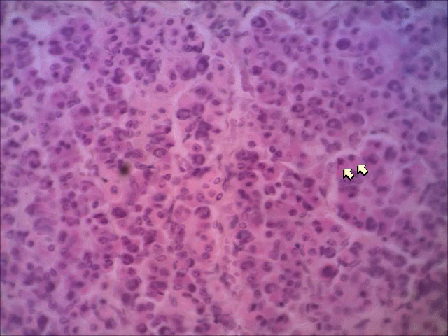These cells produce some of the hormones of the anterior lobe, and then the basophil cells, which have the bluer staining granules, because they're basic, therefore called basophil, produce other hormones of the anterior lobe. Again, you don't have to know which hormones are produced by which cells or even the names of these cells or the hormones. I really just want you to be able to distinguish between the anterior lobe and the posterior lobe. Just like I've mentioned on some of the other slides, the still slides that you see are in the exercise folder on the course site.